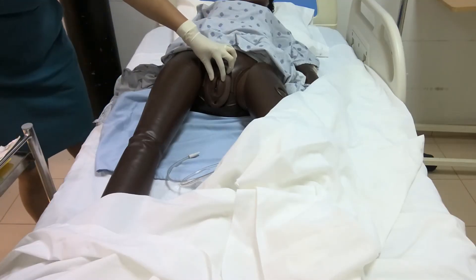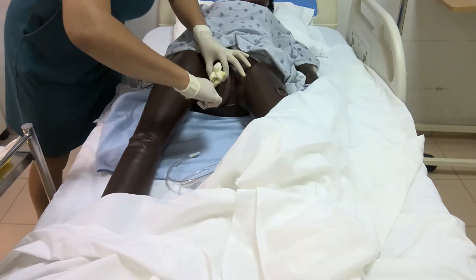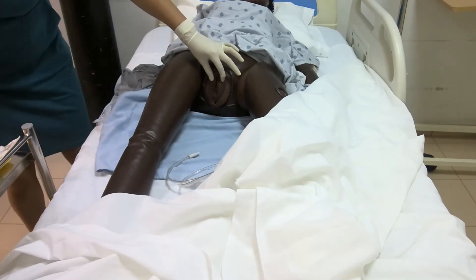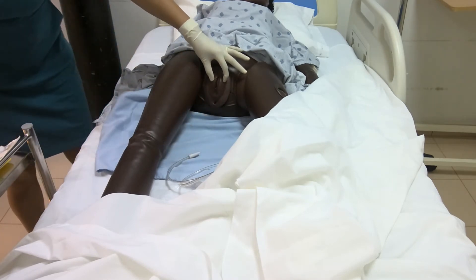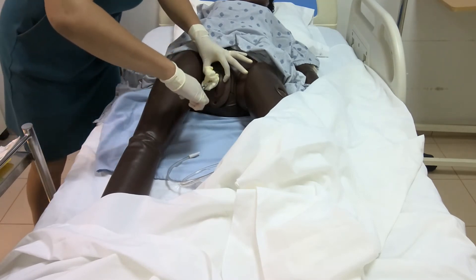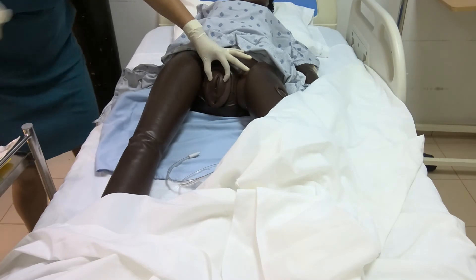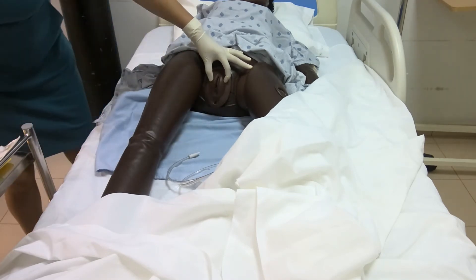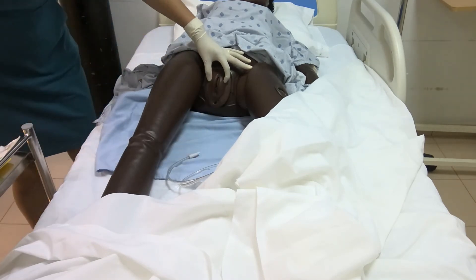For women, spread the labia with your non-dominant hand and ensure that you have a firm but gentle pressure on the labia, since the antiseptic fluid can make tissues slippery, but it must not be allowed to return over the clean meatus.